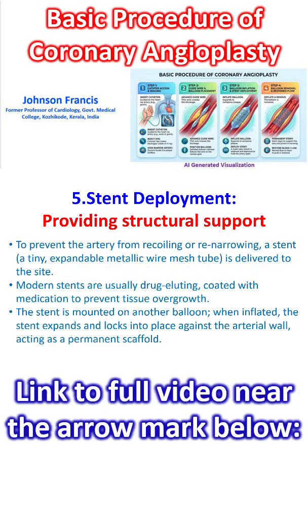Stent deployment, providing structural support. To prevent the artery from recoiling or re-narrowing, a stent, a tiny expandable metallic wire mesh tube, is delivered to the site. Modern stents are usually drug-eluting, coated with medication to prevent tissue overgrowth.